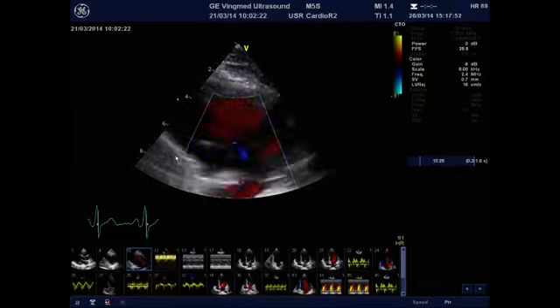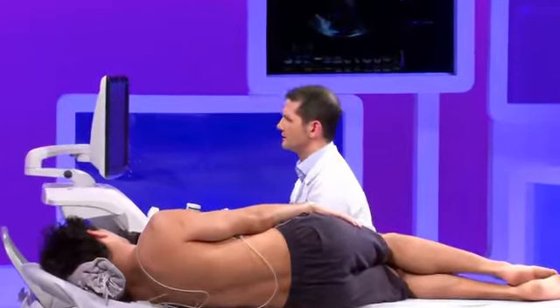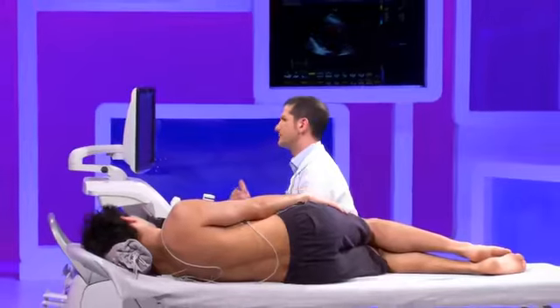Sometimes when patients are normal, this is not easy to get, but anyway, there is mild TR in most of the patients who matter, those who have diastolic dysfunction. So you can see we can find it in several views. Sometimes we find it in the right ventricular inflow tract, sometimes in a modified 4-chamber view.